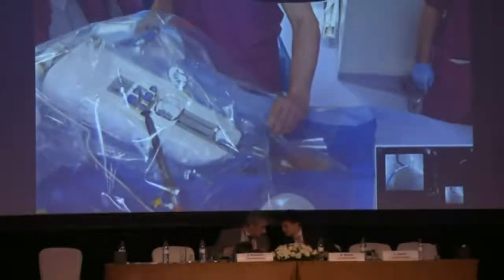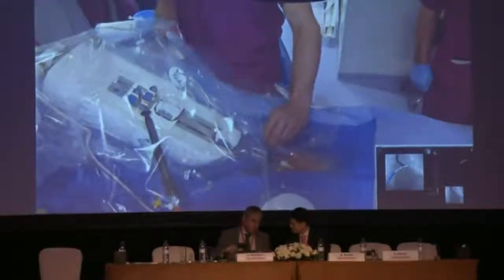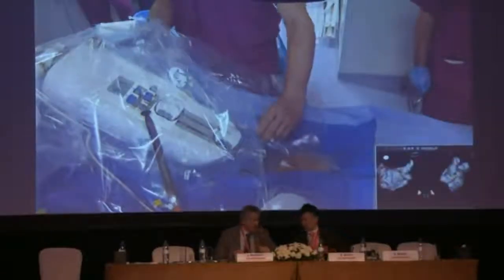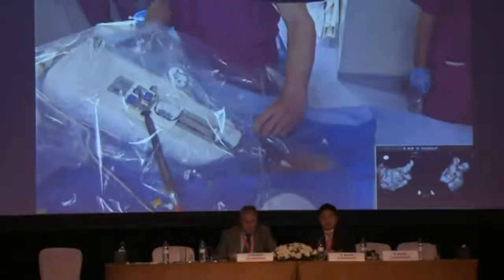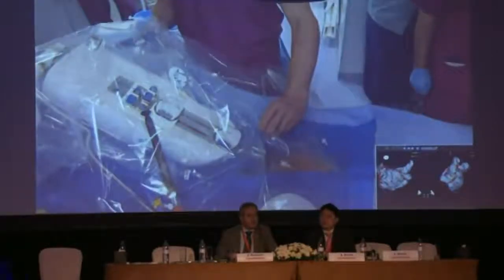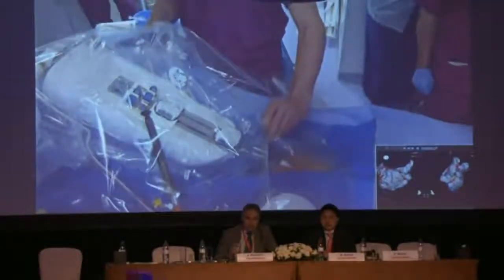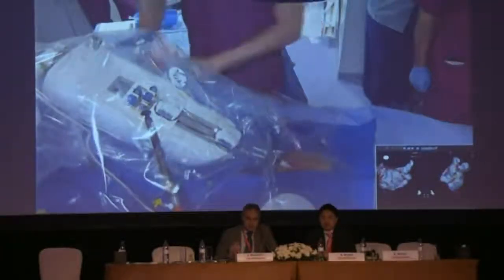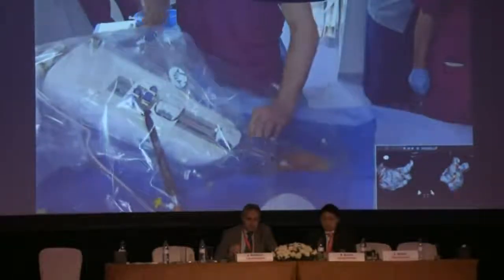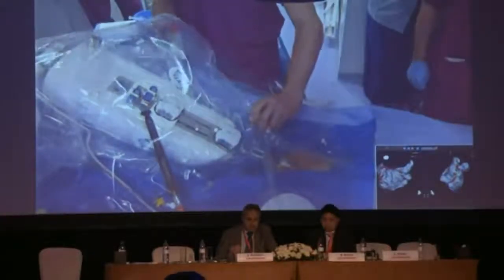I basically kept on dragging my mapping catheter back from lateral to septal until I no longer saw a gradient between the distal and proximal, suggesting that I got to the point where activation was not coming past the proximal electrode and going to the distal electrode, but was actually bridging, in the middle of those two electrodes. So that's how I got there. It was sequential mapping rather than a complete mapping. I just kept on going until I got as early as I could and then stopped.